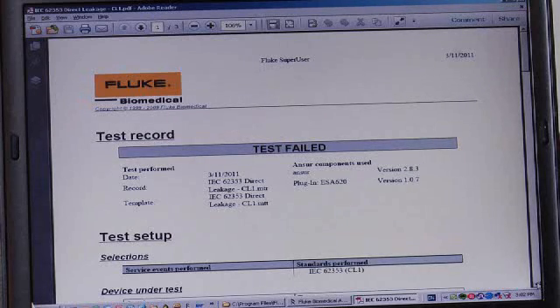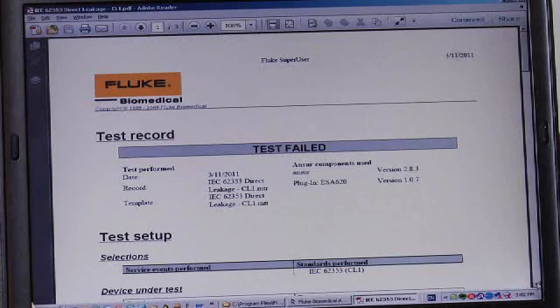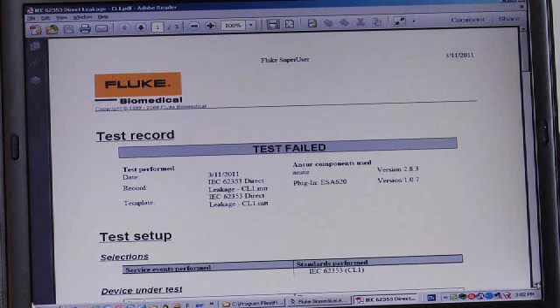Also, you'll see the date that the test was performed. You'll see the test result file name and the name of the test template that was used, plus all of the components of the software that were in use at the time.